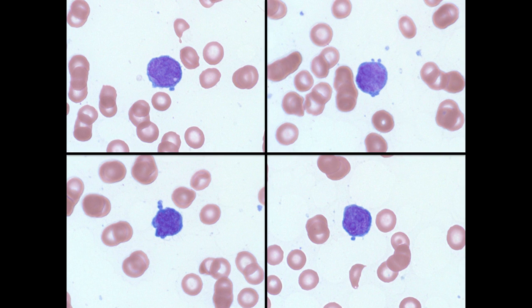Here's another case of big blue blebby blasts in an infant. This one, the chromatin is relatively difficult to describe as whether it's myeloid or lymphoid. To me, it has a certain sort of coarse chromatin quality, but the cells remind me of those transient abnormal myelopoiesis blasts.